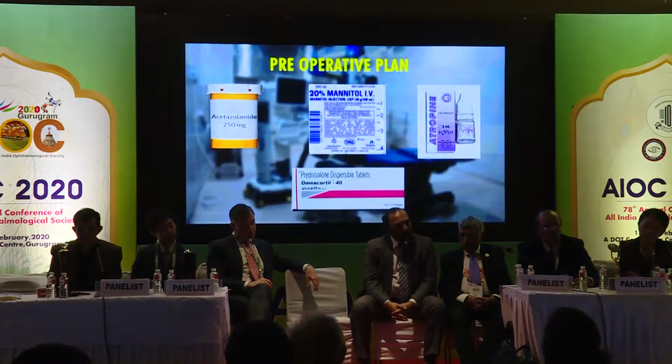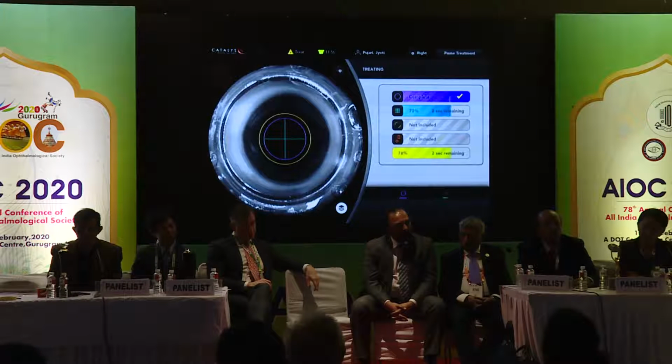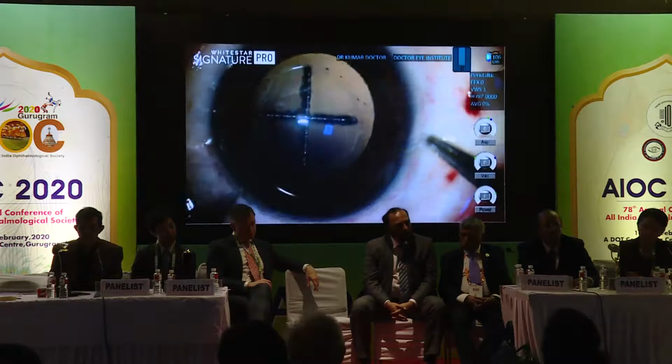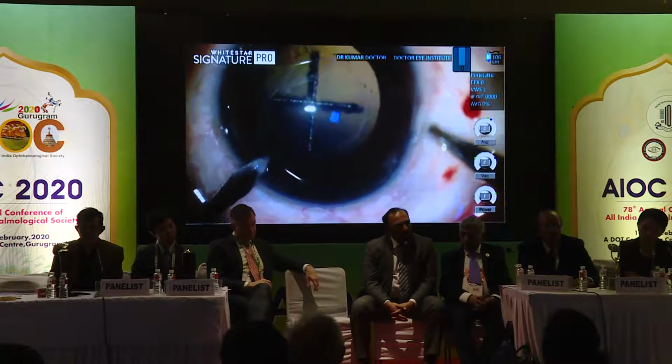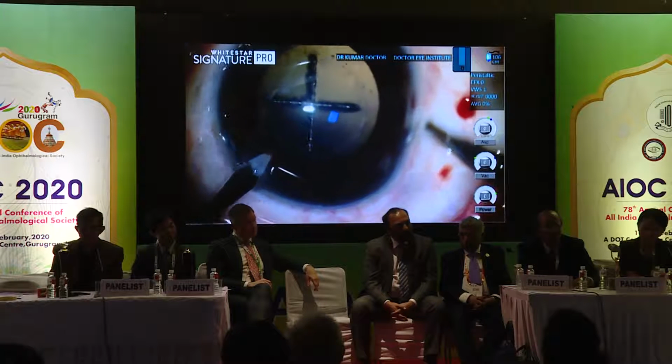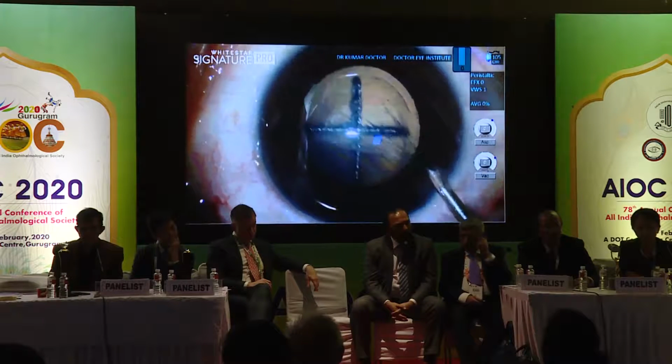Well aware of the various complications known in nanophthalmic eyes, adequate precautions were taken before, during, and after surgery. Patient taken up for femto, rhexis, and a 4-quadrant division of lens performed. A 0.75 mm side port incision made and a gentle release of the aqueous, replaced by an OVD. Using a microrhexis forceps, the CCC was rasped out.